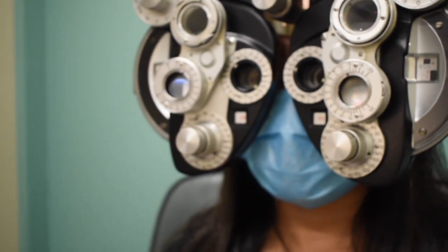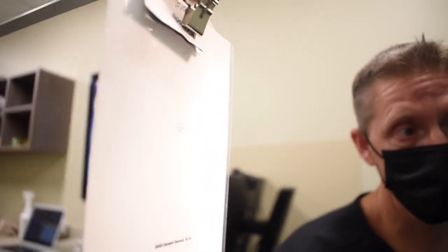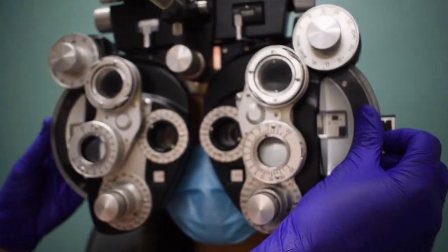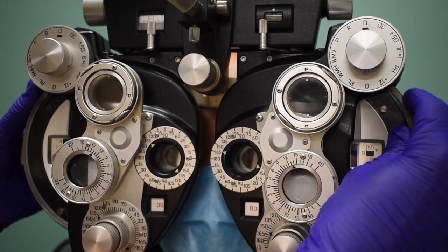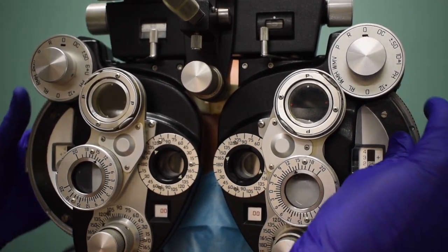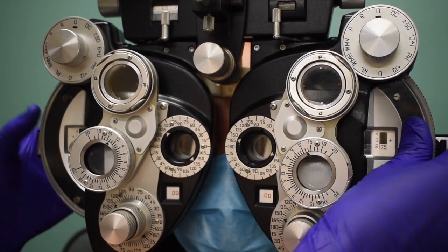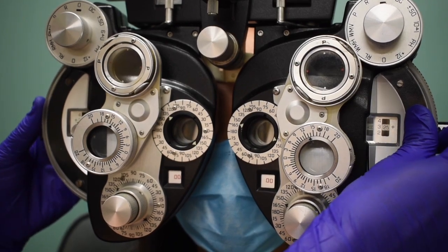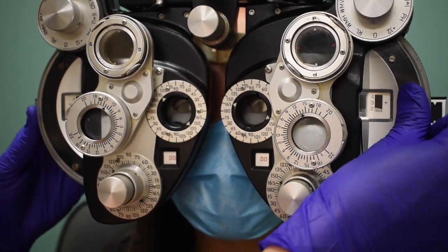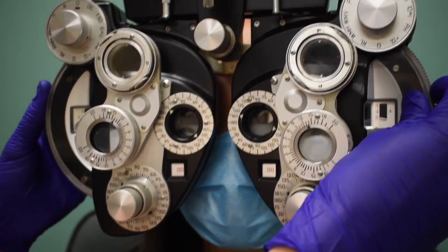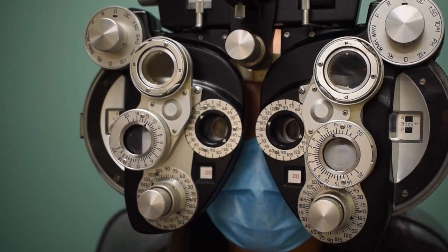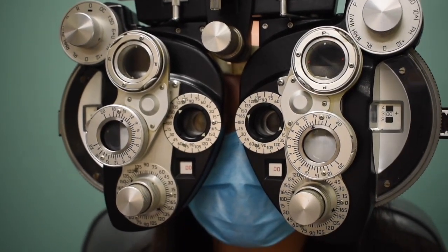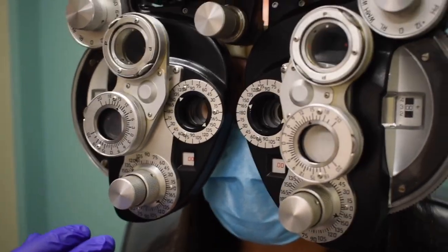And now we're going to go ahead and we're going to roll into our NRA. It will be our next test. As you're looking out here, Phoebe, do you see those letters still? Yes. I want you to tell me when those letters get so blurry you couldn't read any of them at all. Here. I'm going to go 2 past. Tell me when you can read a couple. Here. So here I have a plus 3 over a plus 2.50. So plus 3 is the blur out. Plus 2.50 is the recovery.